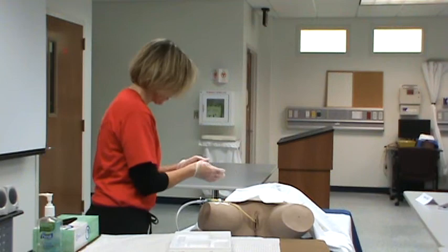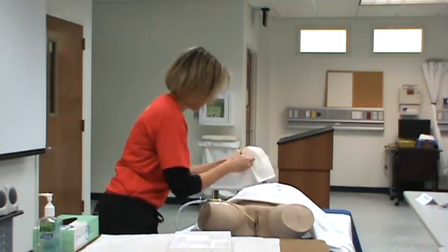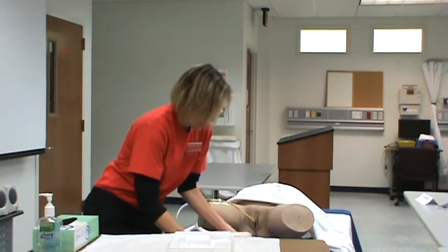Yay. And we're done with the procedure with Mrs. Smith, and we're going to cover her up and perform hand hygiene. And not forget.